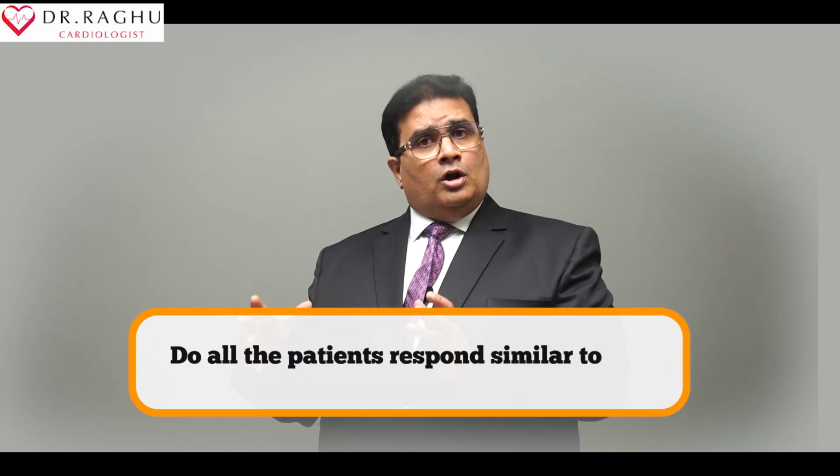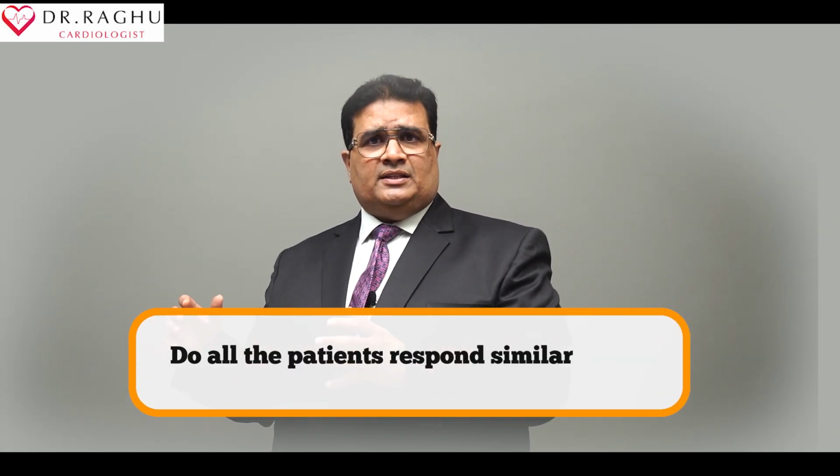That means the ejection fraction will get better from 30 to 40%, or even 42%. That is the ejection fraction improvement we can expect by putting in the cardiac resynchronization therapy. Do all patients respond similarly to this pacemaker therapy?